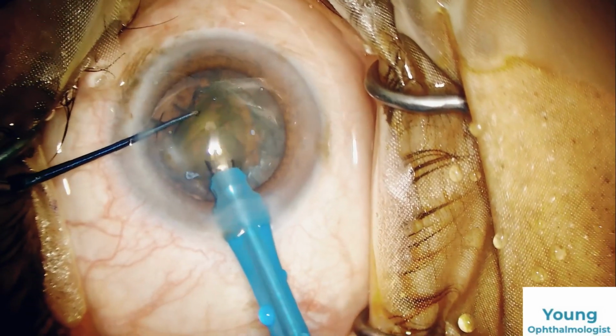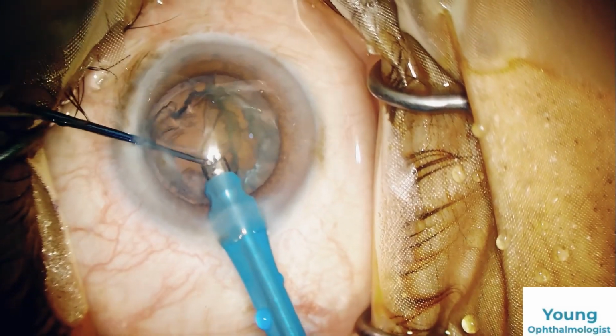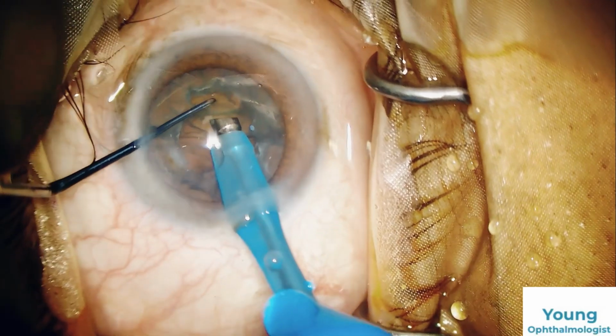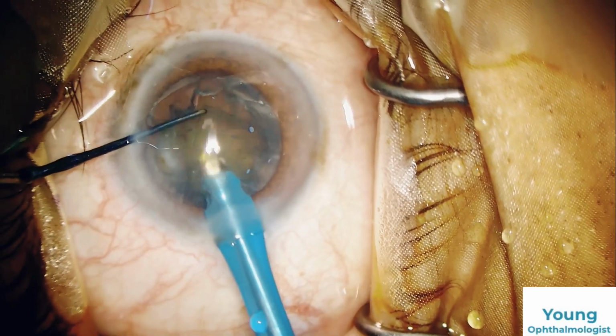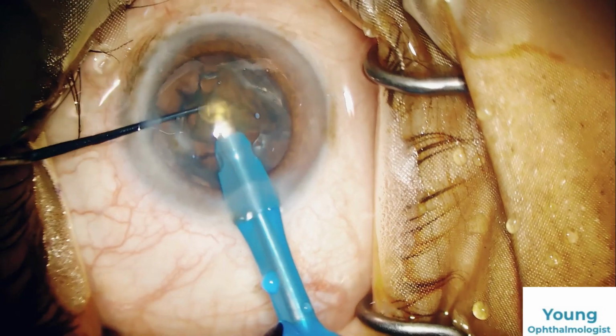Phaco emulsification is done in the central part of the AC, the safest zone. The other hemisphere is brought towards the front. Again horizontal chop and the piece is emulsified and aspirated.